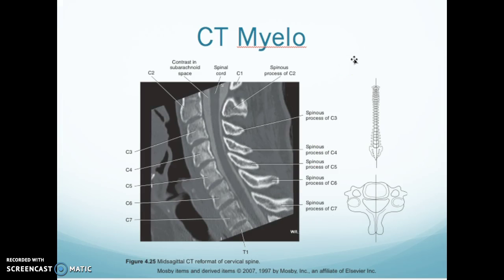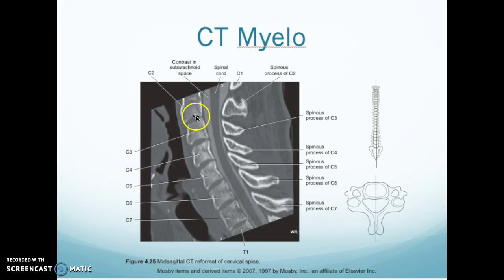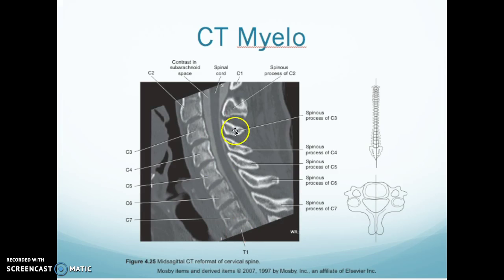This is a CT myelogram — contrast is injected into the CSF, so the spinal cord will not have contrast in it; the contrast will be in the CSF, not in the cord. Here is C1, C2 — you can tell C2 kind of has that seal-nose appearance. That little line there makes me a little nervous. Here's C2, 3, 4, 5, 6, 7, and T1 — exactly the minimum. You can see your spinous processes of C2 through C7. It's hard to count and we shouldn't be clipping that posterior piece off.